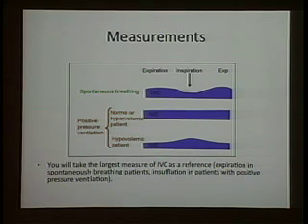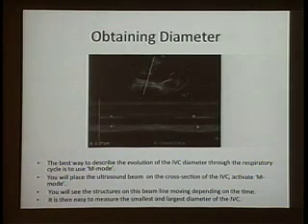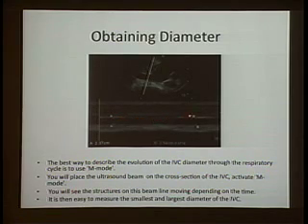i.e. your volume status is. And again, being an intensivist, I pay particular attention to CVP as a gauge for volume. Be very careful with that. But at least it gives you an idea of where your right heart stands. Let's see if I can show you some examples here. Again, you put your M mode, and you can see the diameter is easy to measure here, and you can see if it's much variability or not.